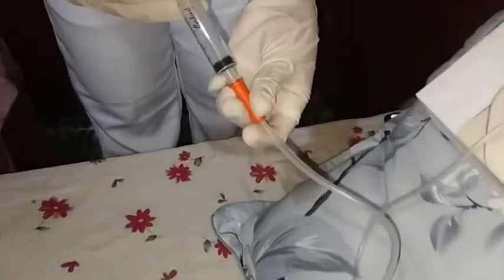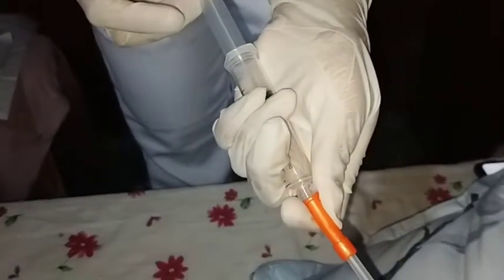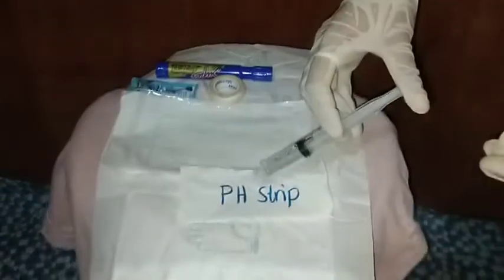Ascertain correct placement of the tube. Aspirate stomach contents, and check the pH, which should be acidic.